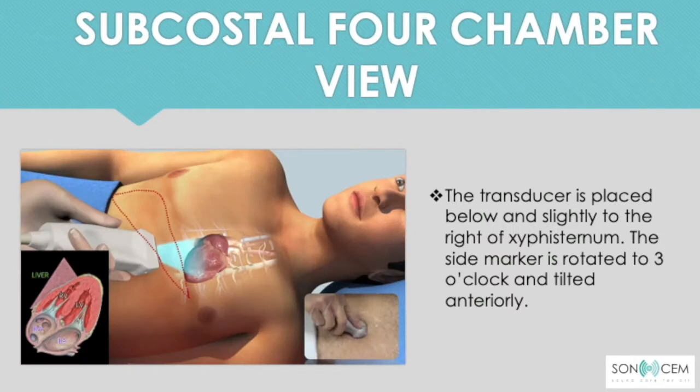We move to the subcostal four chamber view, or we can call it a rescue view. Sometimes if patient is hyperinflated, it's very difficult to get parasternal long axis, parasternal short axis, and apical four chamber. But this view is easy to manipulate. If you are over-tilting, the size will look bigger than normal, for example. This view can help us in diagnosing cardiac tamponade.